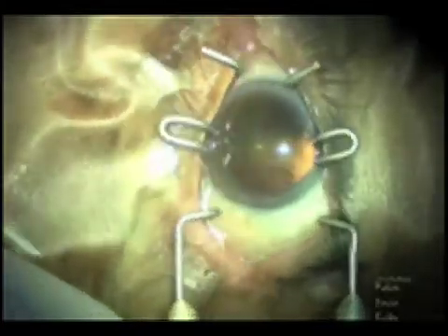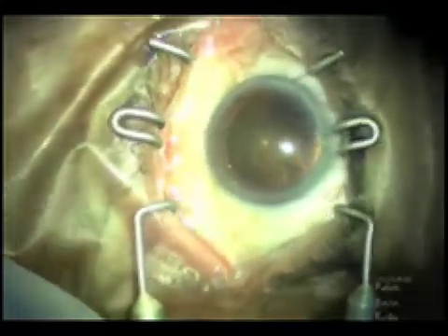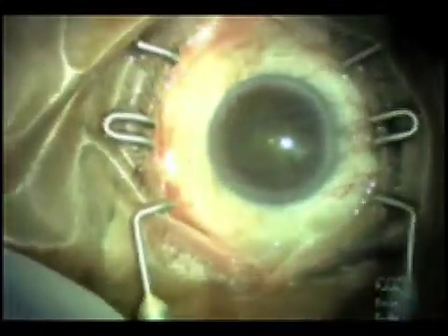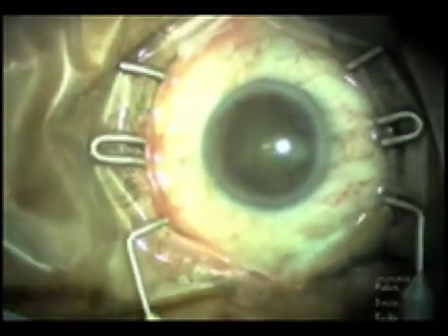The speculum is placed by rotating the superior blade under the upper lid and then rotating the inferior blade beneath the lower lid. The mechanism is then turned to open the speculum to a desired amount.